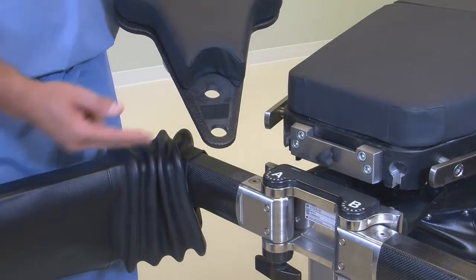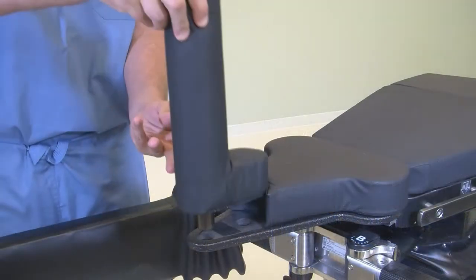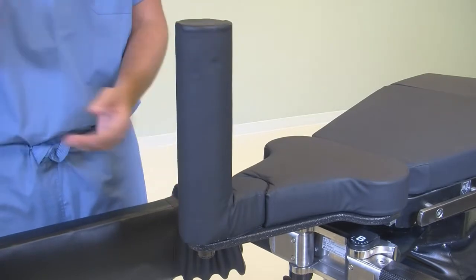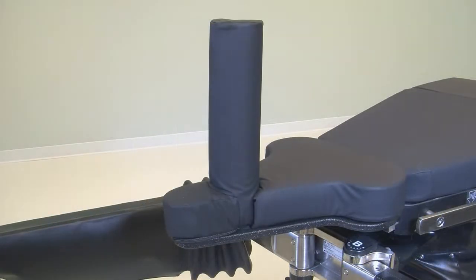There are two hole positions in the sacrorest for perineal post positioning, to improve imaging area with unobstructed views and to facilitate positioning requirements for a range of patients. The selected positions will be made in accordance with good medical practice.